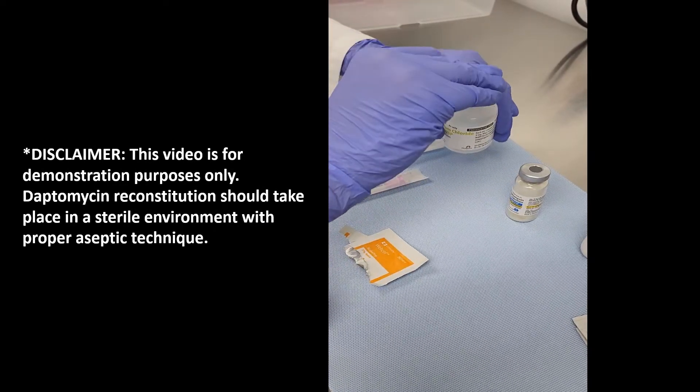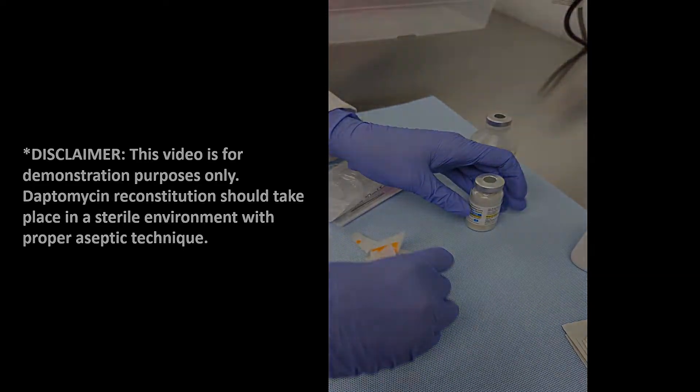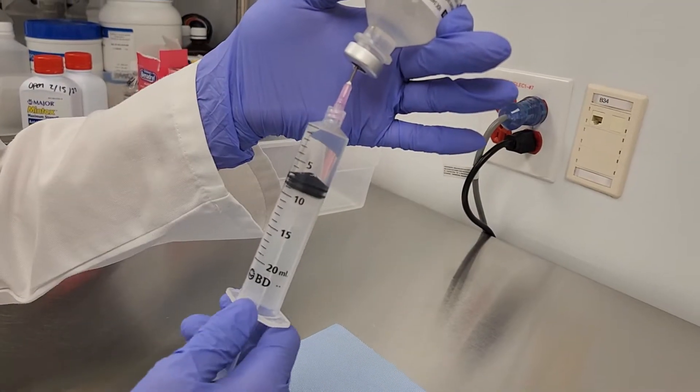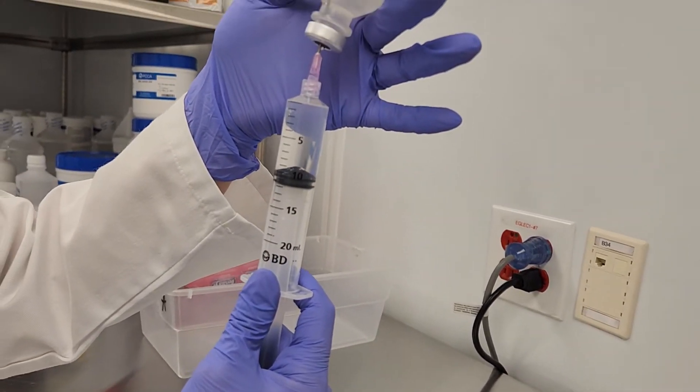Begin by wiping the rubber stops of the saline and daptomycin vials with an alcohol swab. Then draw up 10 mL of normal saline into a 20 mL syringe.